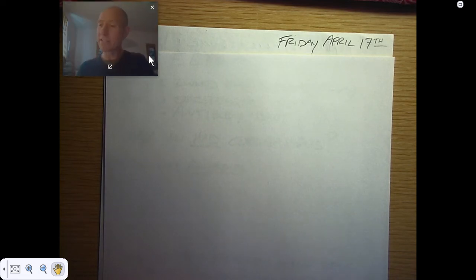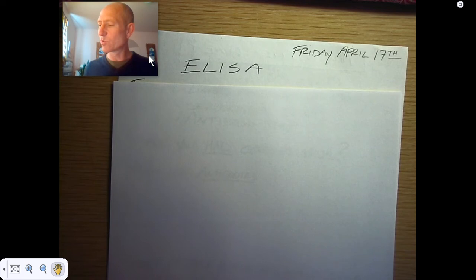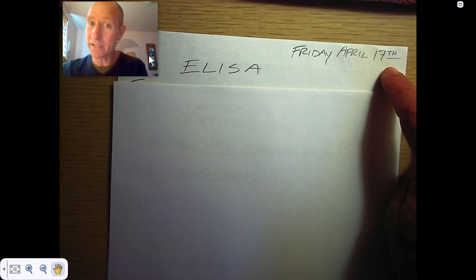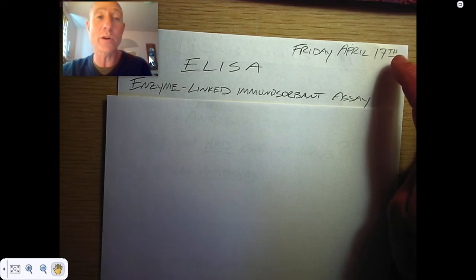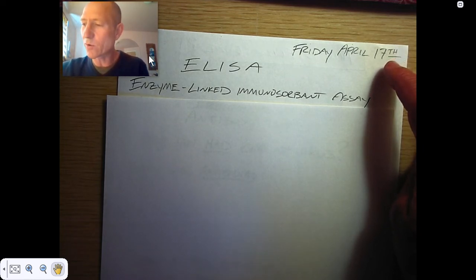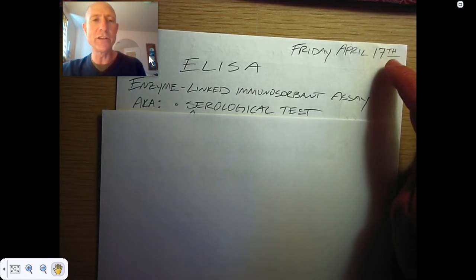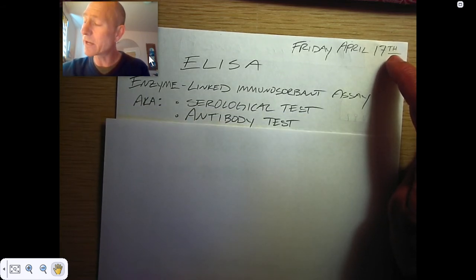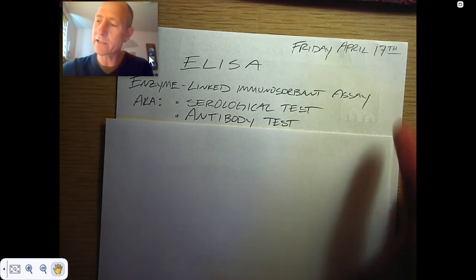Okay, friends. So, Friday, April 17th. We're going to learn about ELISA. ELISA is a cool sounding acronym for an assay, or a test to see if something's there. The assay is called the enzyme linked immunosorbent assay, and we don't even care why it's called that. Sometimes we care, sometimes we don't. This time we don't care. In the news, they call this test a serological test or an antibody test. So when you hear them talking about serological and antibody tests, they're talking about ELISA.